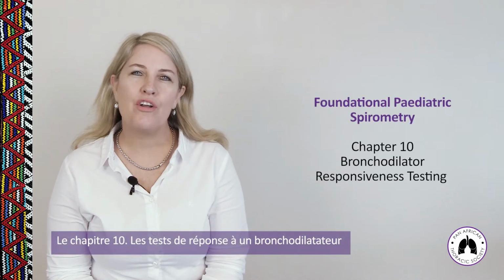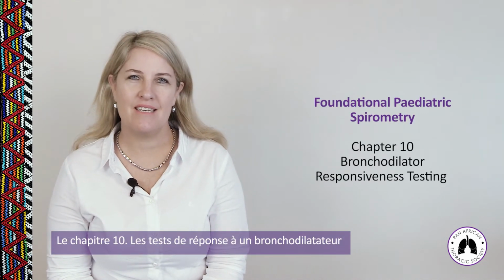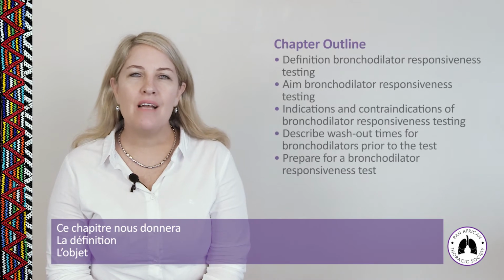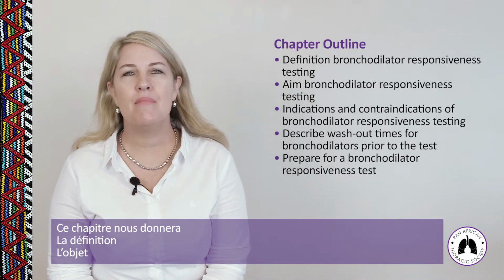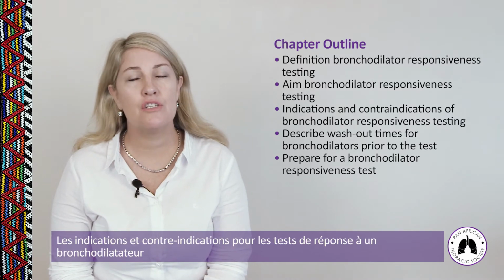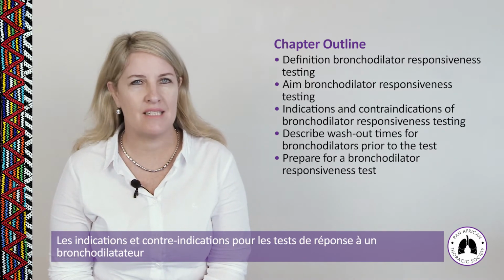Chapter 10, Bronchodilator Responsiveness Testing. So the outline of this chapter includes the definition, the aim, the indications and contraindications to bronchodilator responsiveness testing.